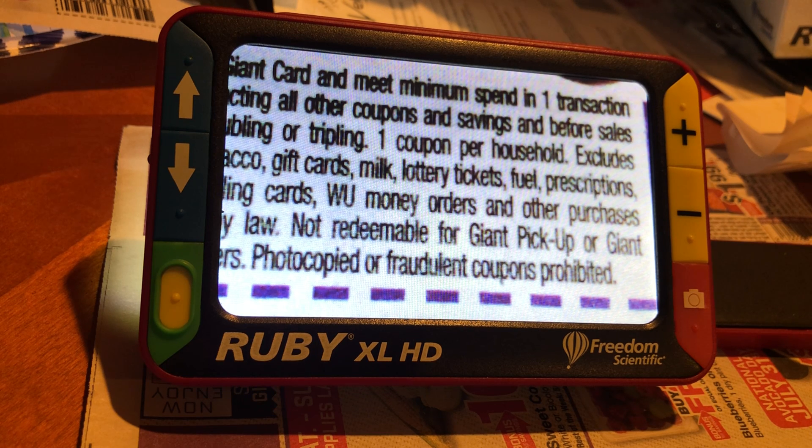This is the Ruby XL HD portable video magnifier. Thank you.